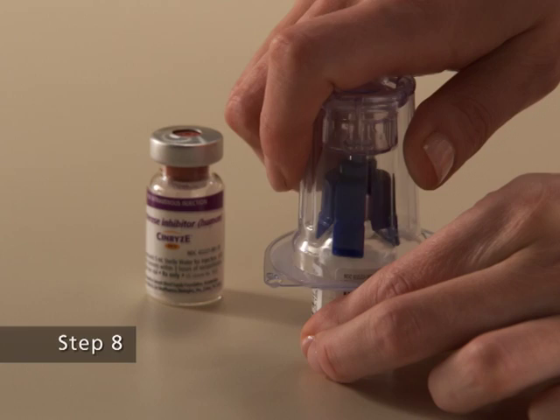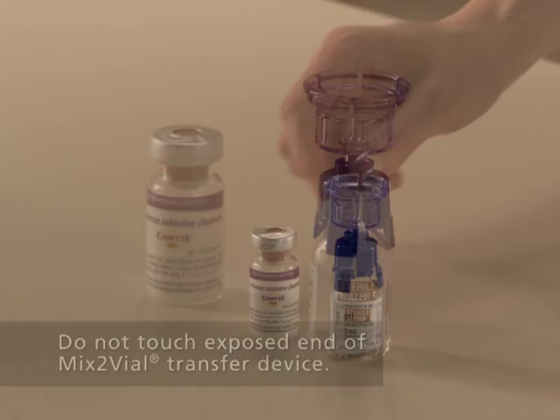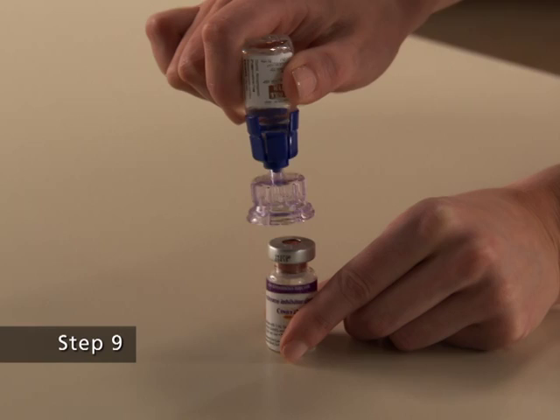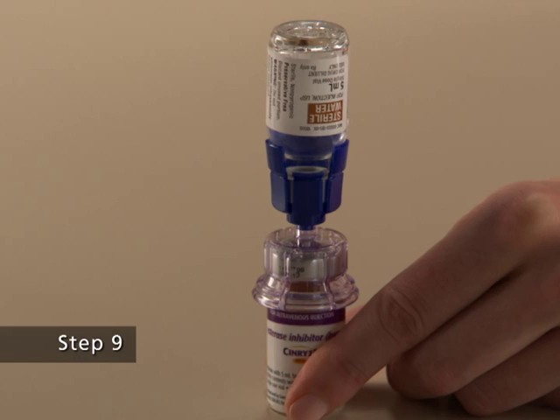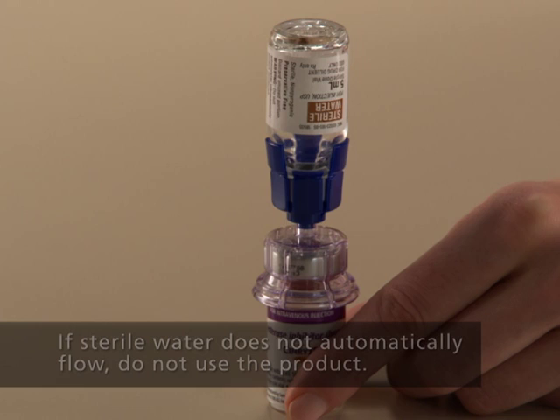Pushing down until the spike penetrates the rubber stopper and the device snaps in place. The Mix 2 vial transfer device must be positioned completely upright before penetrating the rubber stopper. Step 8. The sterile water will automatically flow into the vial of Cinryze because of the vacuum in the vial. If this does not happen, do not use the product.